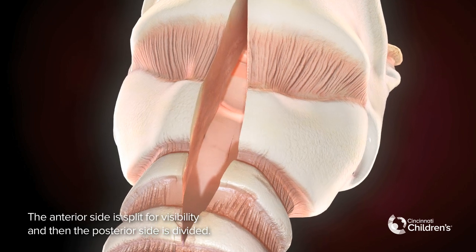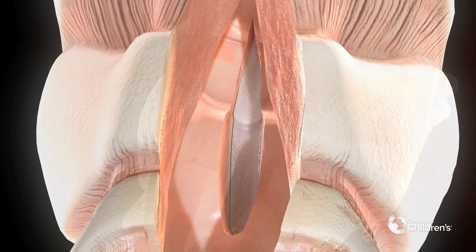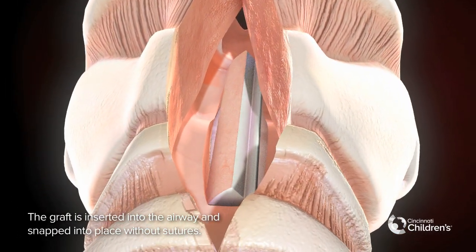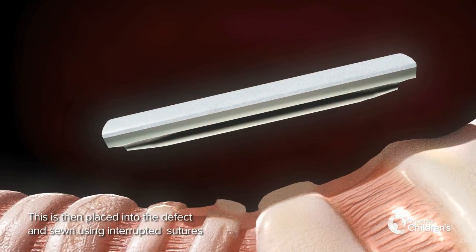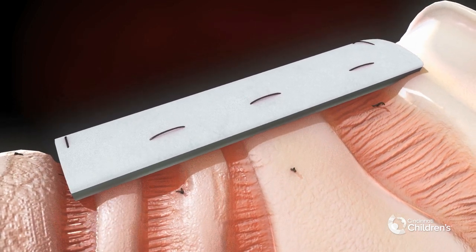The anterior side is split for visibility and then the posterior side is divided. The posterior graft is inserted into the airway and snapped into place without sutures. The anterior graft is then placed into the defect and sewn using interrupted sutures.